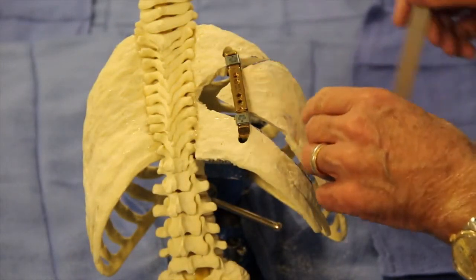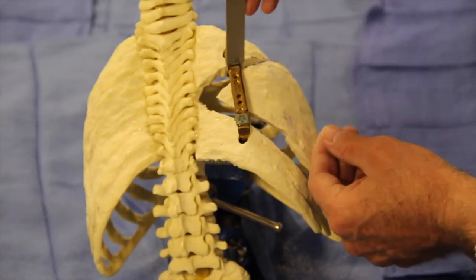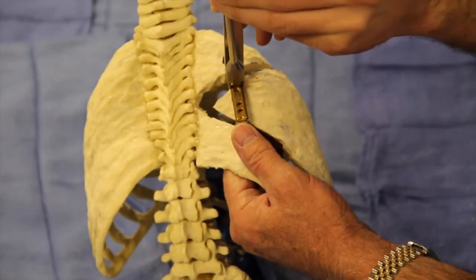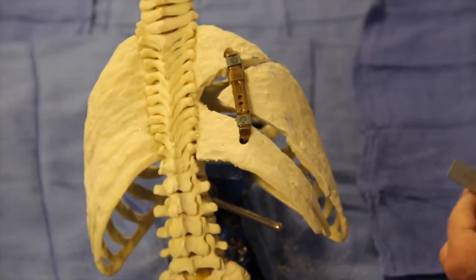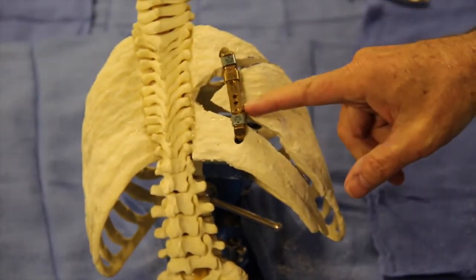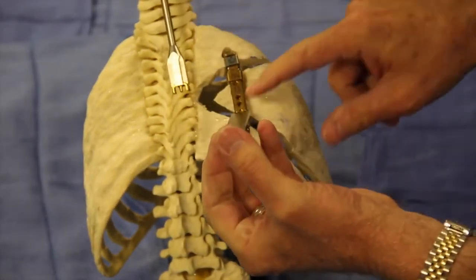Now, using the shim — which is available in the Vector 1 set — you distract apart the device so the holes line up, and then use a distraction lock. First, proximally, it is tapped in, and the lock inserter is next used to secure it. Then distally, the same is done: the shim is inserted, and then the lock is placed in.